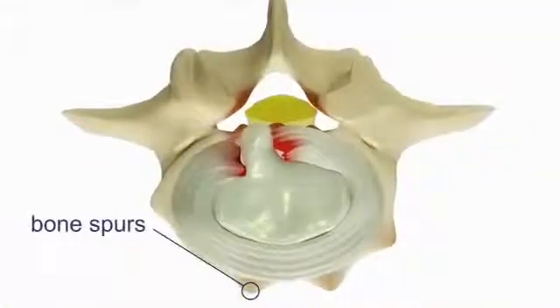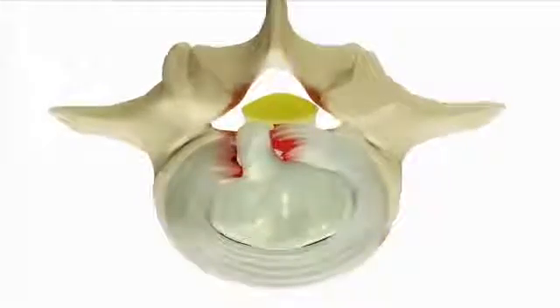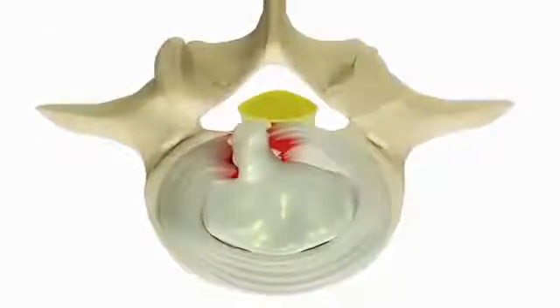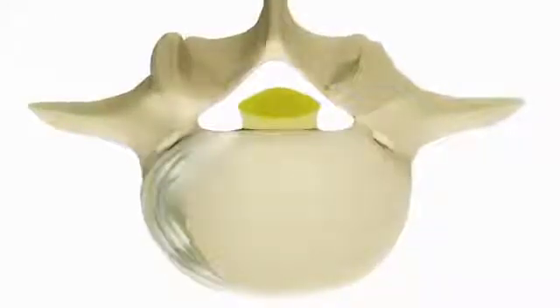First, any bone spurs and disc material pressing on the nerve is removed and the opening around the nerve enlarged. Then the surgeon will remove almost the entire disc between the vertebrae to create a clean space for fusion between the bones.